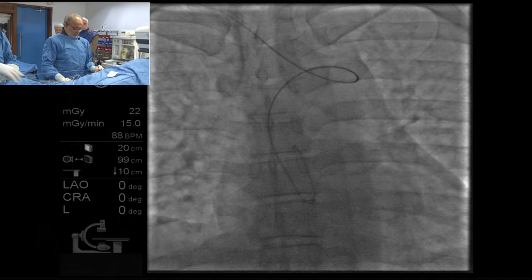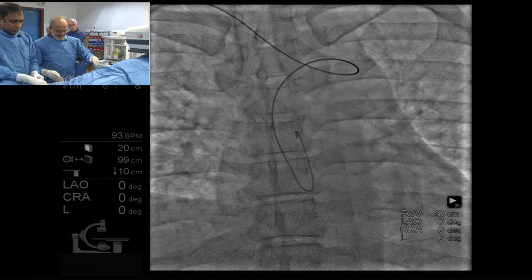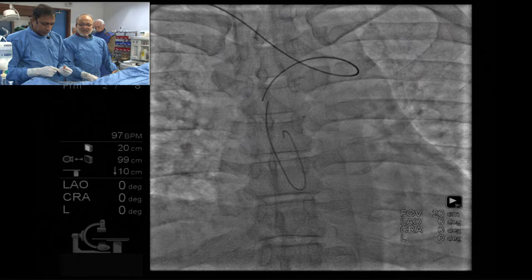There is the signature curve of the wire. It looks like that in most cases. Roller coaster. Roller coaster, right. Yes. Yeah, he is opening the curve. Rajni is opening the curve. He has opened up completely.